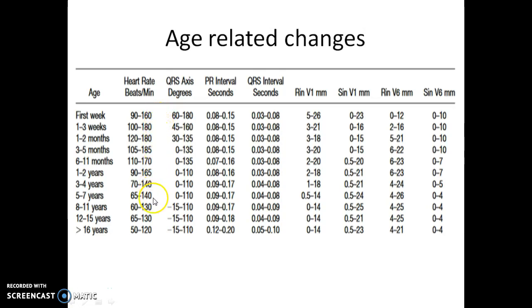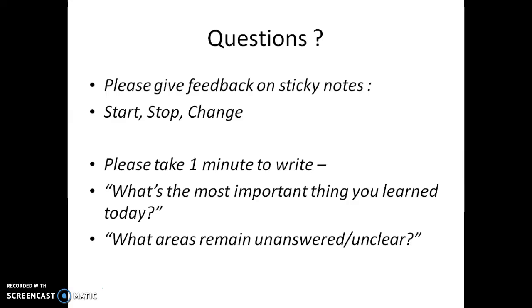Or just to emphasize, heart rate reduces, your QRS increases gradually, the axis becomes normal, so leftward from rightward, and you don't need to memorize this. These tables are freely available and they're in apps. We'll post it up as well.